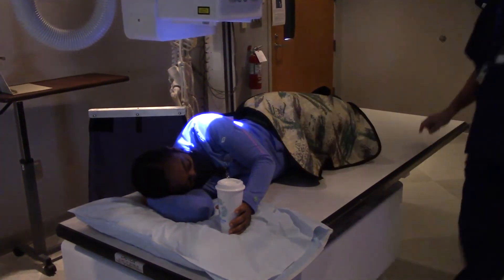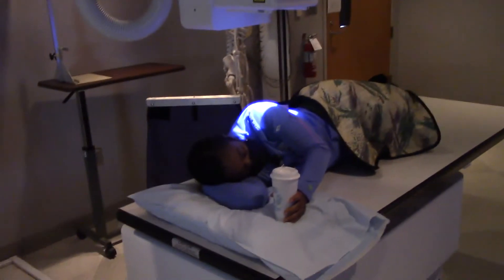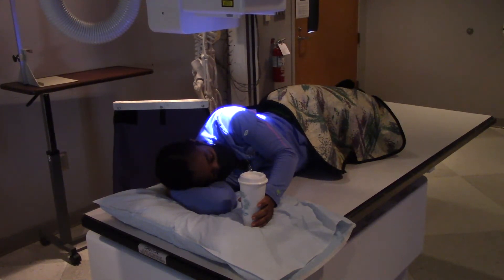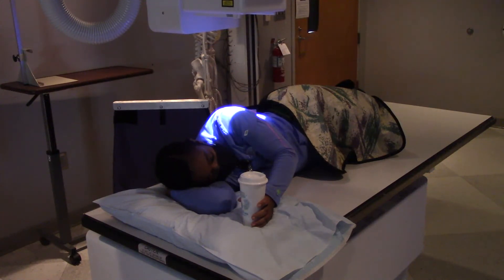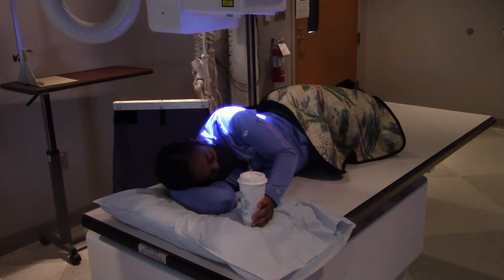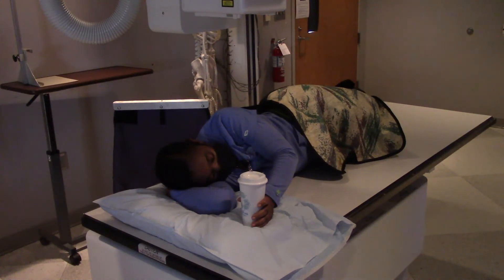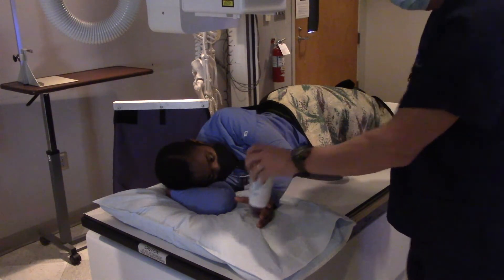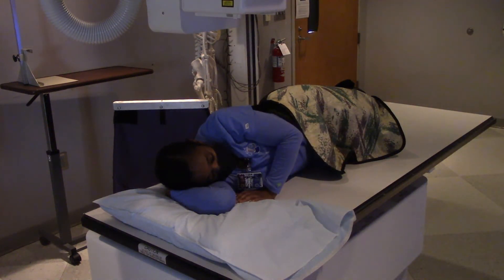Very good. All right ma'am, same thing as before — whenever I tell you to start drinking, just take some nice steady sips of that white stuff and drink it on down for me. All right, here we go — start drinking. Beep! I'm going to wait until she's got a couple of good sips before I actually make my exposure. All right ma'am, you can relax once again. And as you know by now, relaxation is a temporary thing.